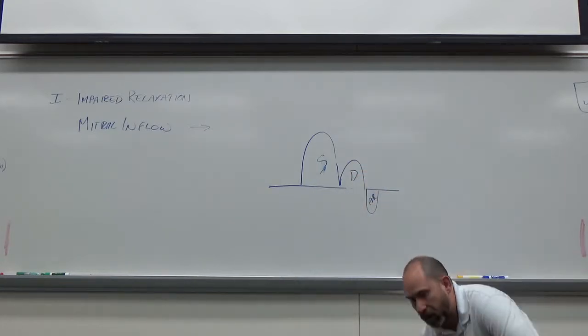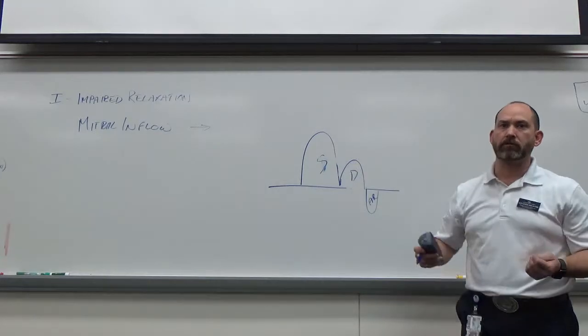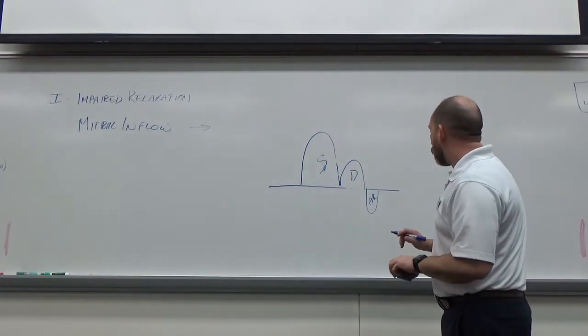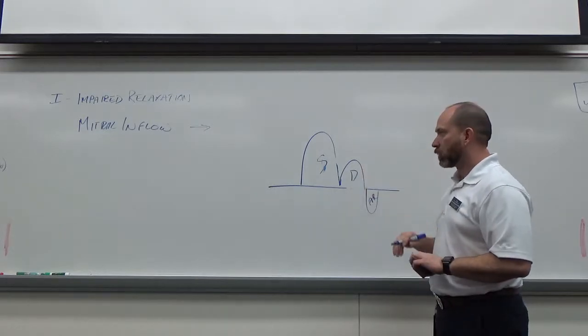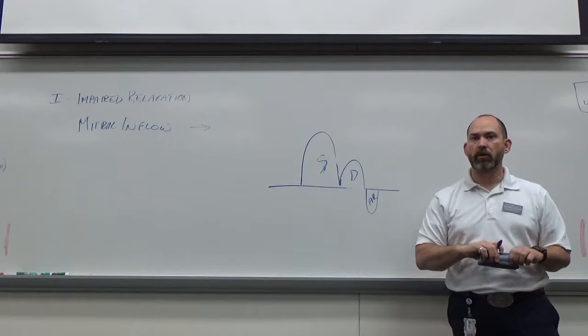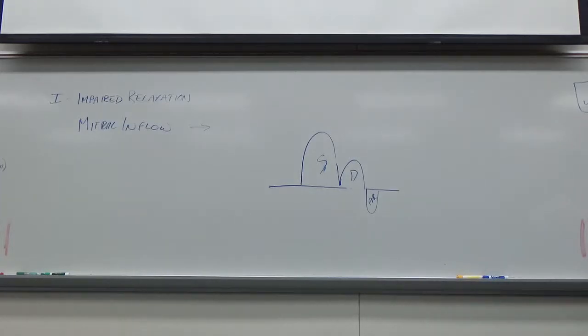We'll just draw that as AR. What does that stand for? The A reversal, yeah. So this is depressed a little bit, and what about our A wave? Okay, so let me see.